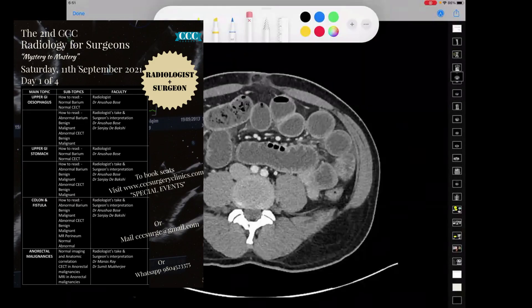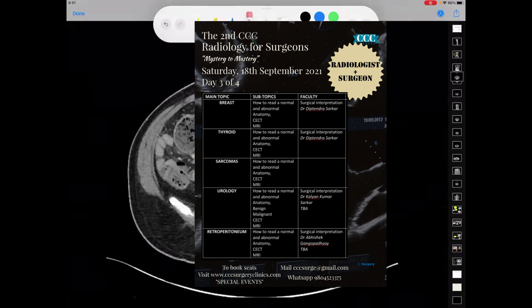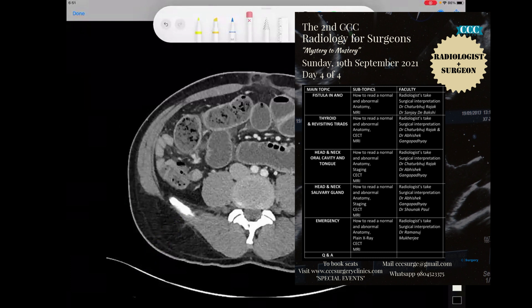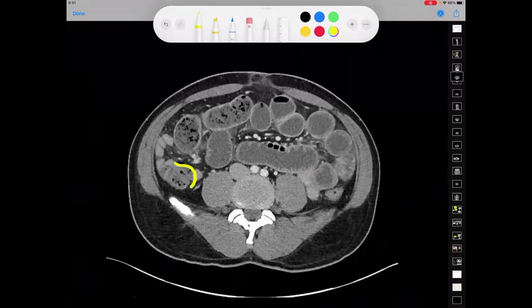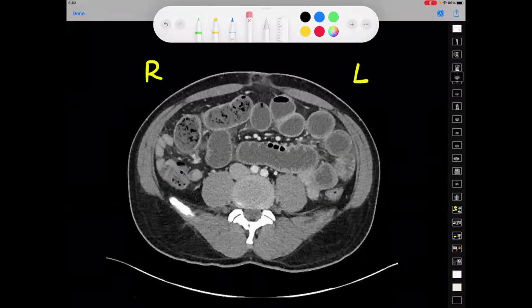This can be the 12th rib, which means this could be taken at the level of around L2 or L3. You can see multiple loops of bowel here. The large bowel is usually situated like this — this is always the right side and this is always the left side. You can see the right-sided bowel and the left-sided bowel as well.